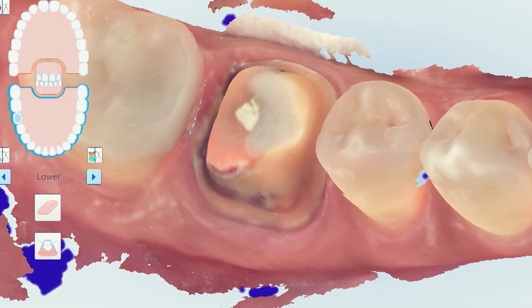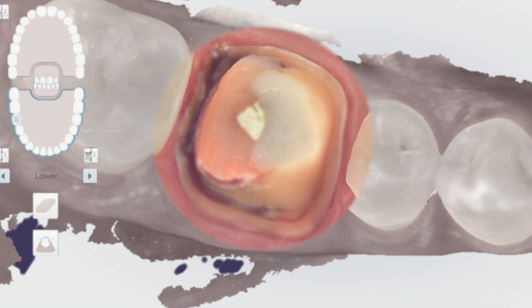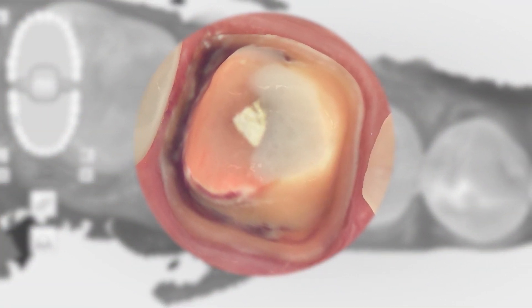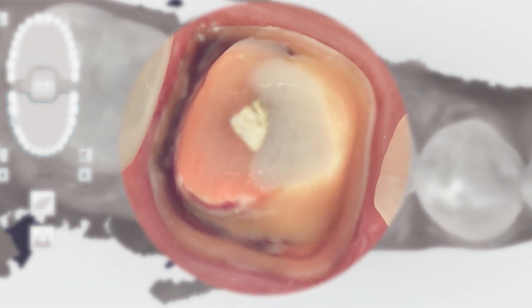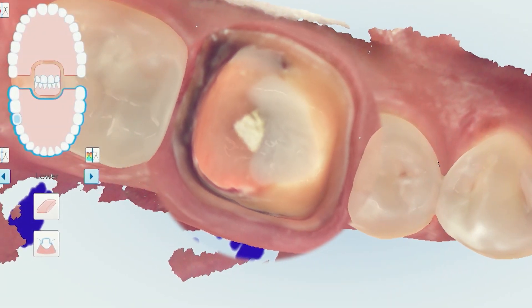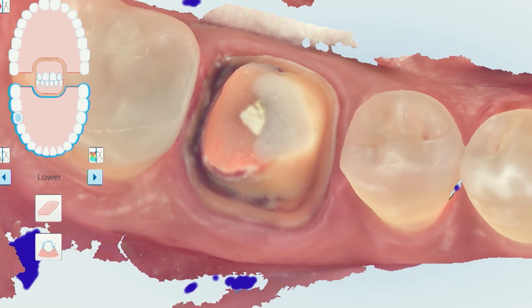Next, probably the most important aspect of the entire quadrant scan is the prep itself. You want to make sure the occlusal of the prep, the axial surfaces of the prep, and the margins are all filled in so they're not missing any critical data points. If there are any holes within that, you definitely want to capture and fill those in.